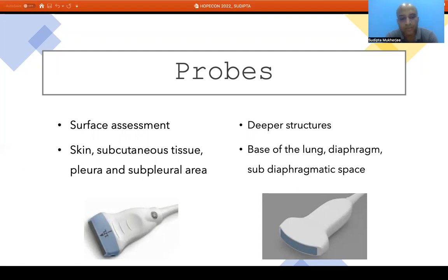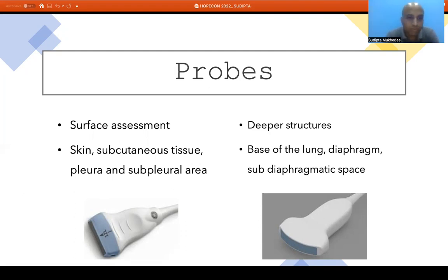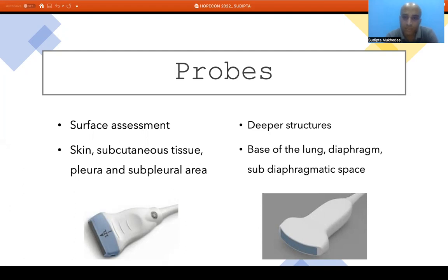For lung assessment, we use either a linear probe, a vascular probe, or a curvilinear probe. The linear probe has a higher frequency, better resolution, and poor penetration, so it is used for surface assessment — skin, subcutaneous tissue, pleura, and the pleural area. The curvilinear probe has a lower frequency, poorer resolution but better penetration, and is used for deeper structures such as the diaphragm, base of the lung, and subdiaphragmatic space.